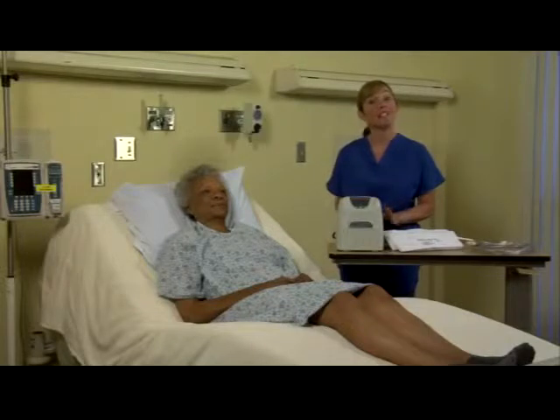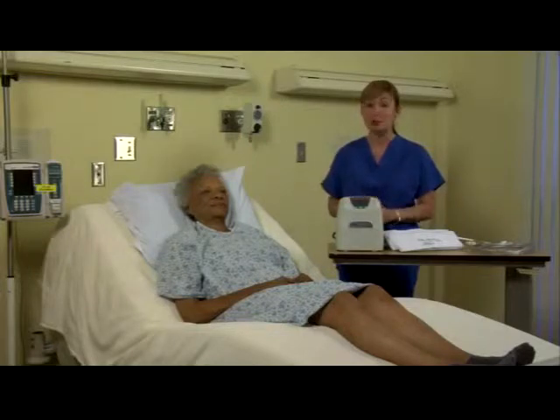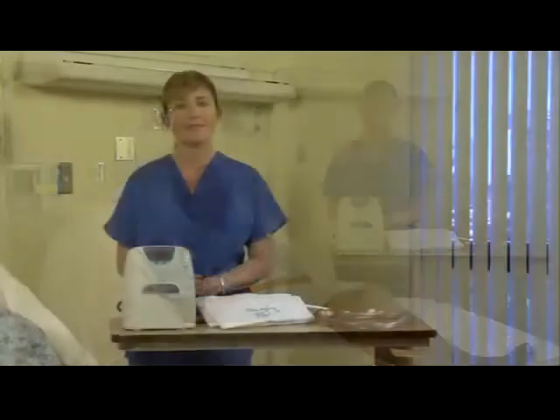Venaflow Elite is the only DVT compression device that mimics ambulation, and consequently, it's proven to reduce DVT rates by 50% versus other devices. Today, I'm going to demonstrate how to use the Venaflow Elite device, as well as how to troubleshoot any issues that may arise.